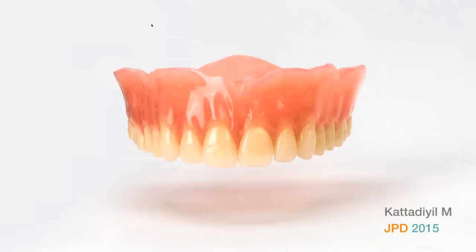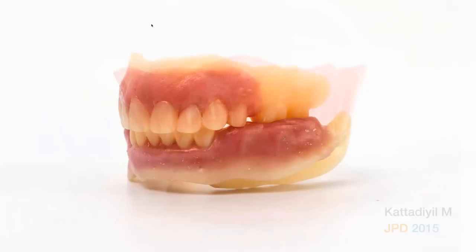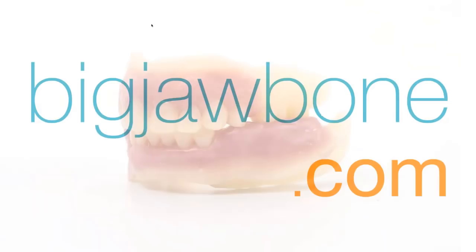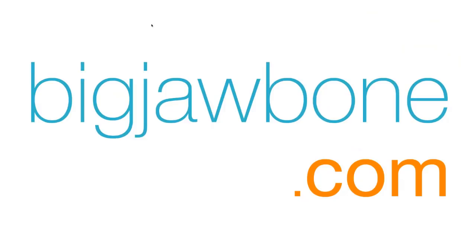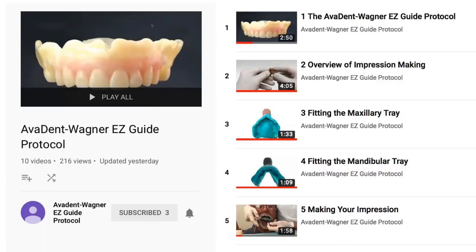I'm going to show you how to make a very high-quality digital denture like you see here using a working model. This is not the denture at all — none of the teeth you see here will be used in the final product, but it's a working model that will allow you to modify and customize a denture at the second appointment rather than the traditional fourth or fifth appointment. All of this is on my website, bigjawbone.com. On YouTube, just type in AvaDent-Wagner and it'll take you to 10 videos showing everything I'll talk about tonight.